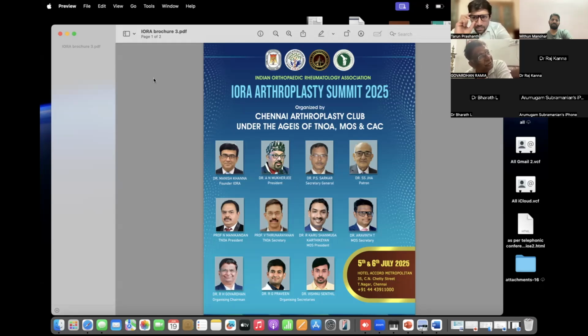You don't do osteotomy routinely. As Bharat said, you should do a good lateral release. The posterolateral corner has to be released, like what we do on the posteromedial side for varus. You do it on the valgus side, releasing all the structures as well as taking out all the osteophytes. Most of the time, you will be able to get things right. You do your pie crusting of the IT band, and you will be able to balance the knee.